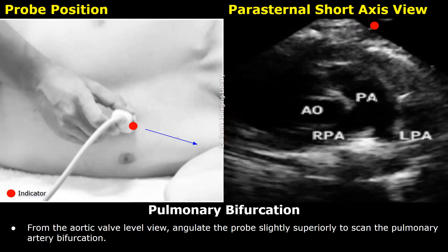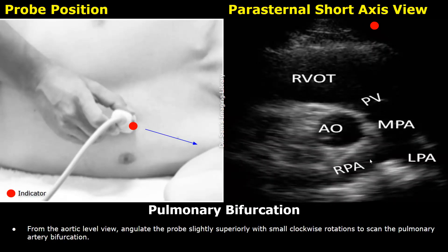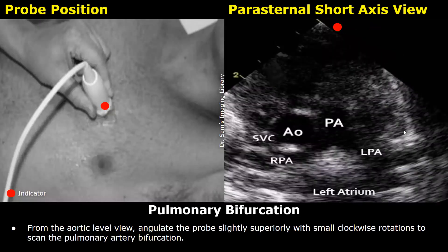From the aortic valve level, slightly angulate the probe superiorly to get the pulmonary bifurcation view. You will see the main pulmonary artery dividing into the left and right pulmonary arteries. The aortic root is seen in the middle in cross-section, surrounded by the right ventricular outflow tract. With slight clockwise rotations and small superior sweeps, you can also see a part of the left atrium and a part of the superior vena cava.